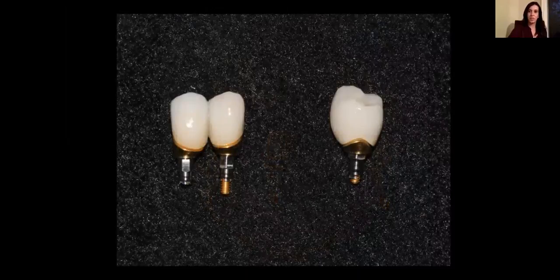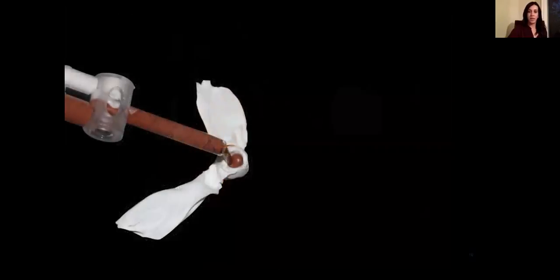And so the objective is that you want to create, or I created, a dummy or a duplicate abutment, and it's a very simple chairside technique that you can use. So what you're looking at here is the crown with some Teflon tape just placed on the intaglio surface of the crown. And we simply inject a silicone, a PVS bite registration material, into the crown itself.